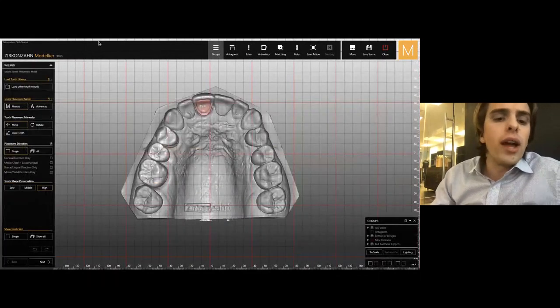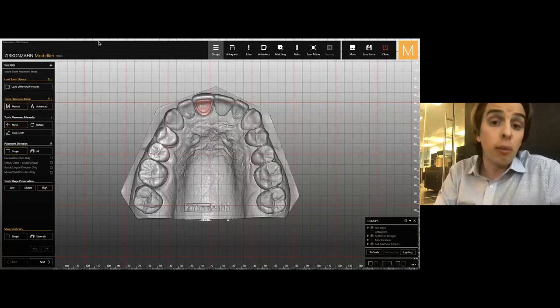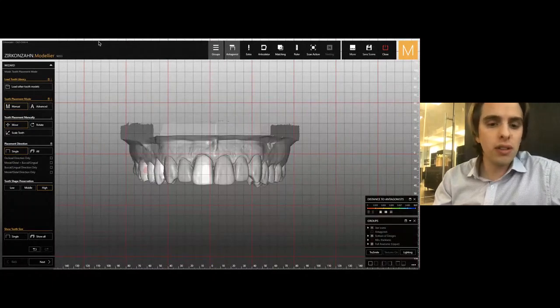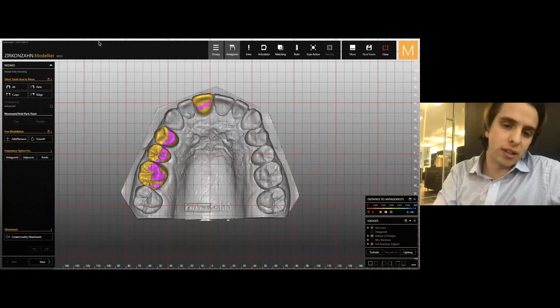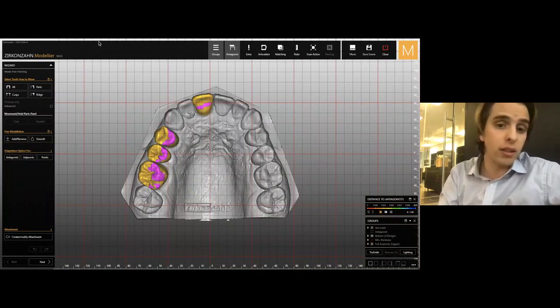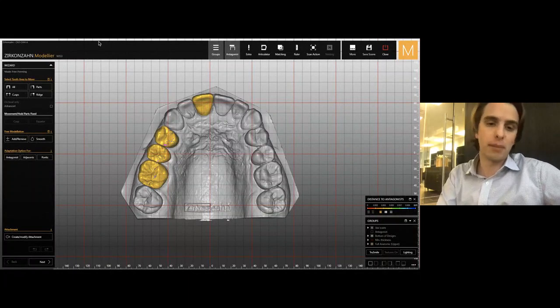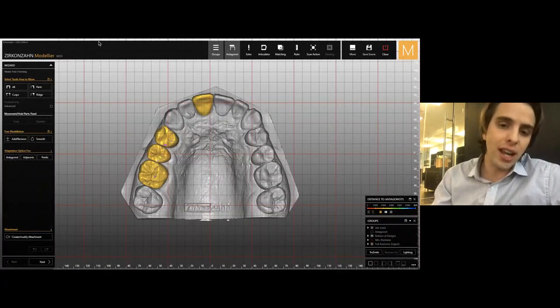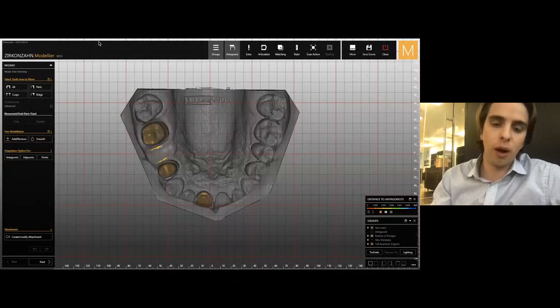So we go and we select the tooth library of our choice. The teeth come into an arbitrary position, and we will go to reposition everything for a functional and aesthetic tooth setup here. Now, in the free-forming phase, we can start to assess the contact we have with the antagonist, and we can build this out so we have the appropriate stop centrics, and we can adapt these elements, of course, to the adjacent teeth, and we can adapt the pontic to the gingiva as well.